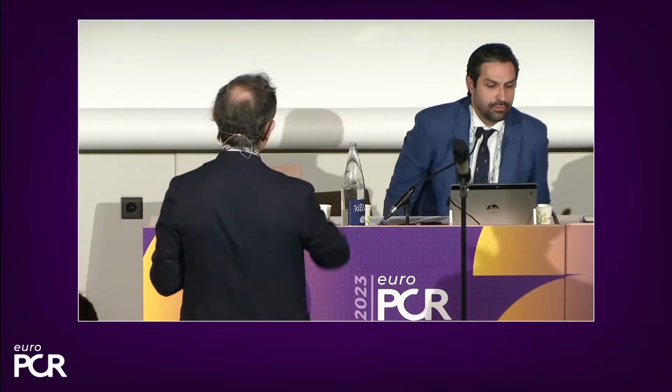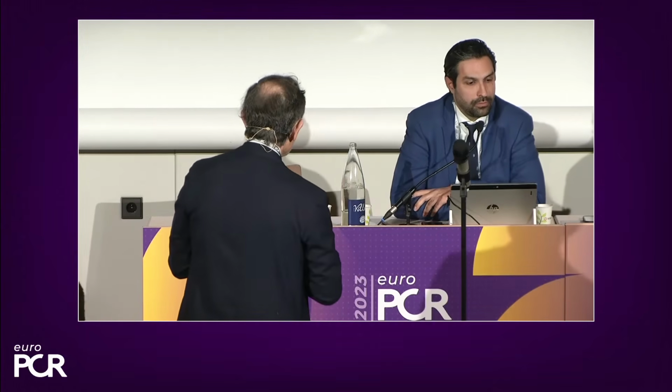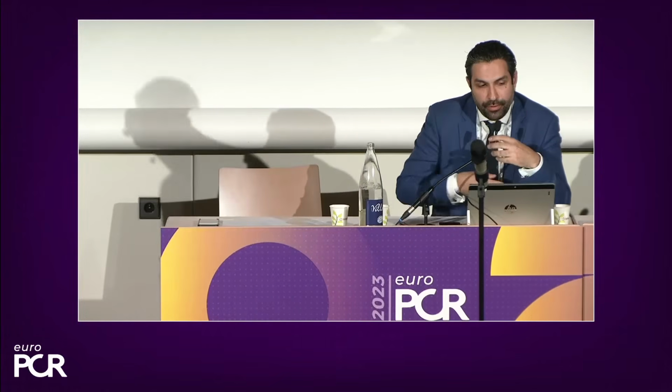You have a 3D in the upper side, and then you have a different view. Tell us a little bit what it means, how you are scrolling, what you are going to get. So the thing is that by being in the three-dimensional space, you can actually rotate in any plane, Julio. You can even do a fly through in the stent if you want to do that. These reconstructions allow you to do that completely.